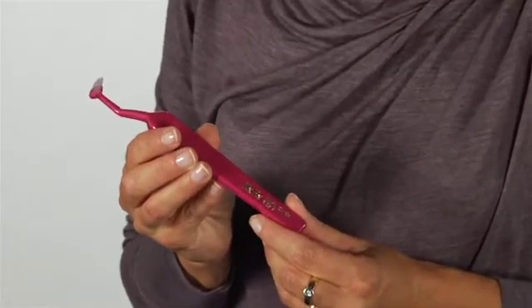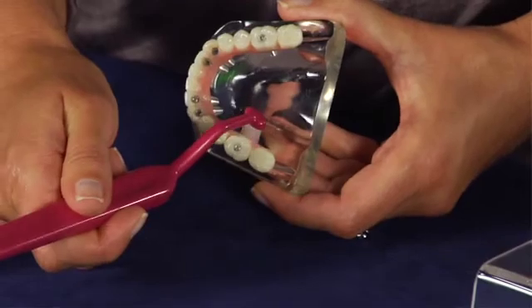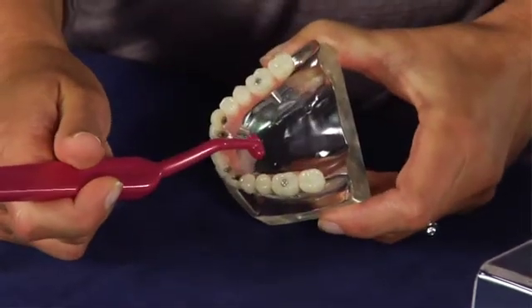TP Implant Care is a brush with an angled neck and a slim brush head for easy cleaning of the implant from the inside.